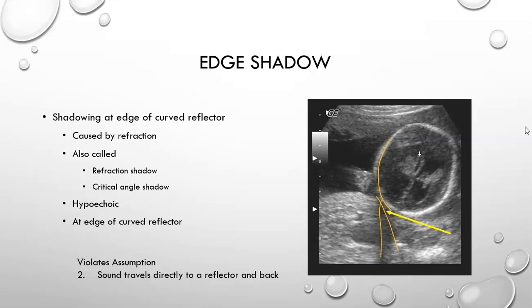And this again violates the assumption that sound travels directly to a reflector and back. It gets to the reflector, that's for darn sure, but it doesn't come back because it bends off and goes into Never Never Land.